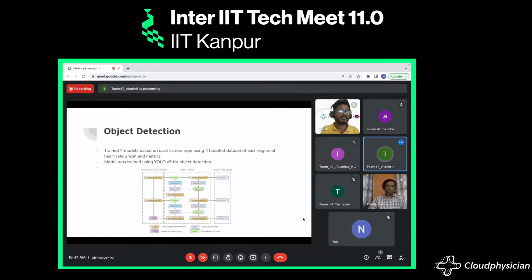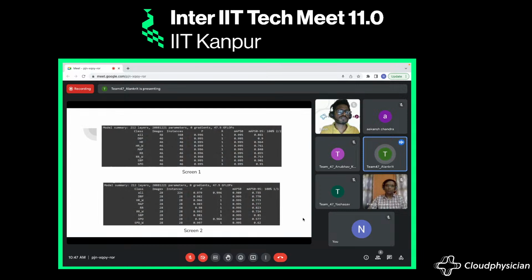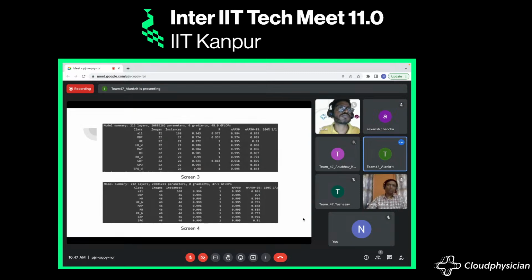Then for object detection, we used YOLOv5. In YOLOv5, we had a 4-label dataset for each screen, and these are the screen results, where the accuracy is about 91%, 97%, and 80%, depending on the screens. Each dataset had approximately 4,200 images.